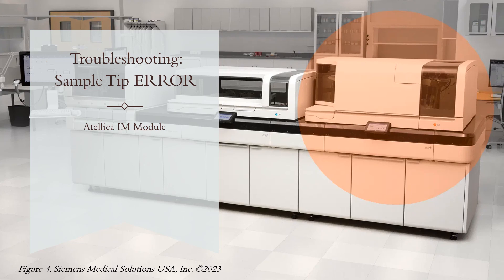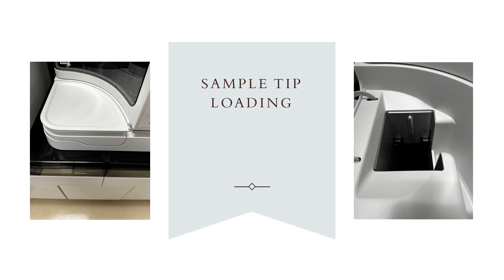Moving on to the sample tip tray error. This is the IM module of the Italica. The red arrow indicates where the sample tips are loaded, and this is where it often jams when loading new tips. The green arrow shows where the tip tray waste and cuvette waste products are all located. This is an area to check for jams first — a lot of times there will be an empty tip tray jammed on the inside of the tip tray loader that cannot release into the waste, indicated by the red arrow, and that is often the likely culprit.